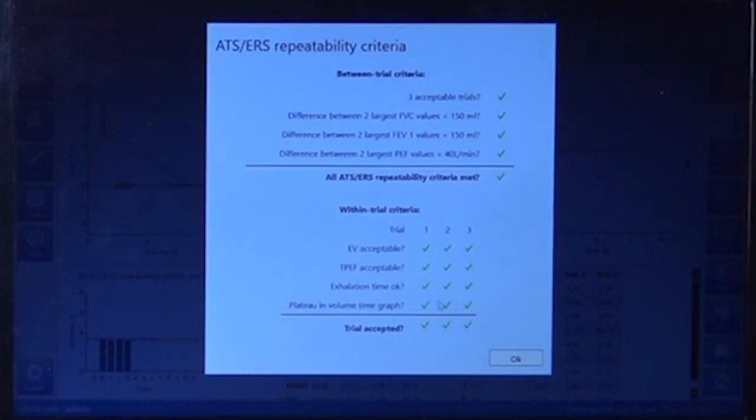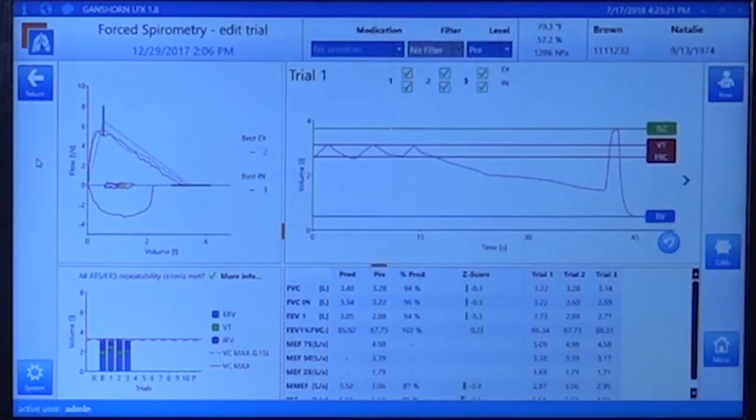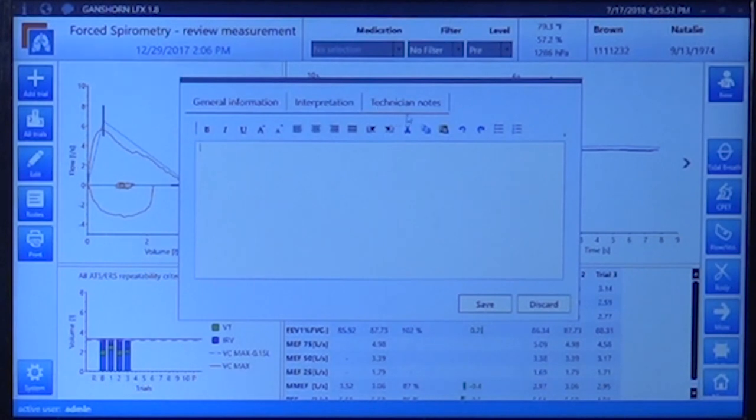If you click the edit button, you can select which trial is best according to your judgment. You have trial one, trial two, and trial three, and can eliminate any trial — for example, if you performed four trials and the first was an outlier, you can eliminate it and keep the repeatability of the others. Clicking on 'Notes' lets you enter technician notes in a word-like format, general patient information, and view the automated interpretation of the test. In this case it says it is a normal test and the spirometry results are within normal limits. If you agree, just save; otherwise discard and enter your own interpretation.